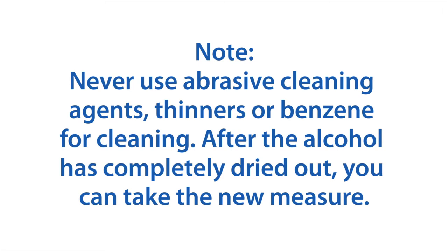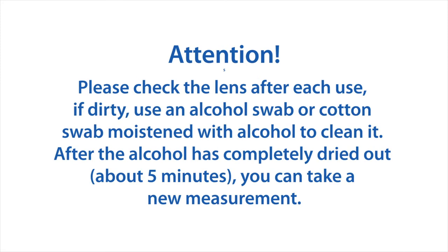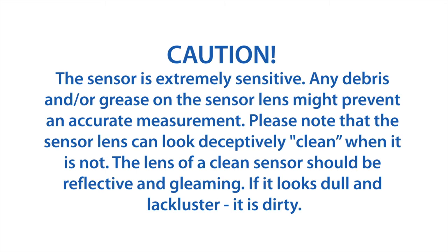After the alcohol is completely dried out, you can take a new measurement. Please check the lens after each use. If dirty, use an alcohol swab or cotton swab moistened with alcohol to clean it. After the alcohol has completely dried out — about five minutes — you can take a new measurement.